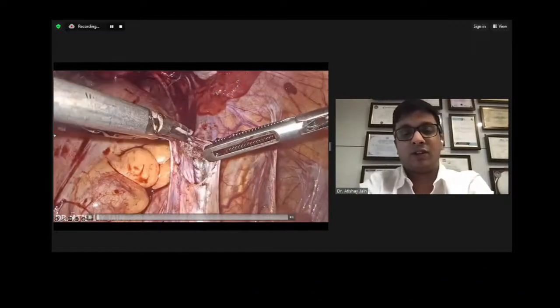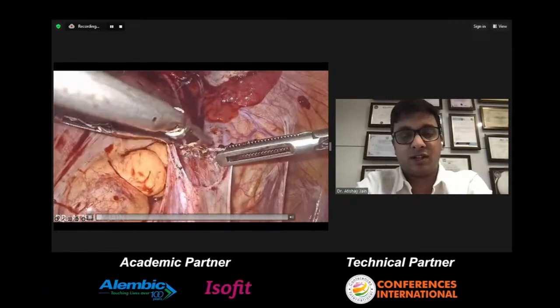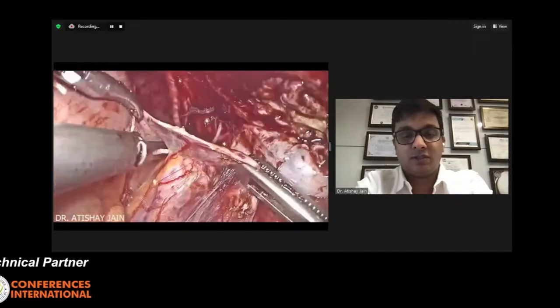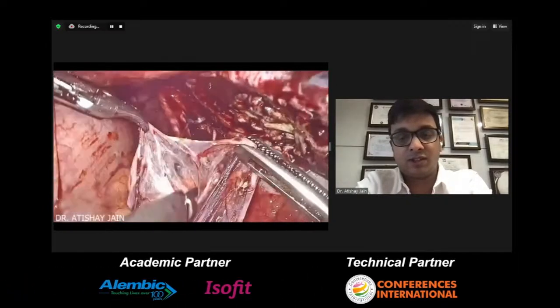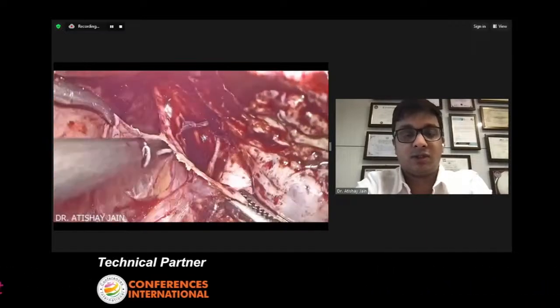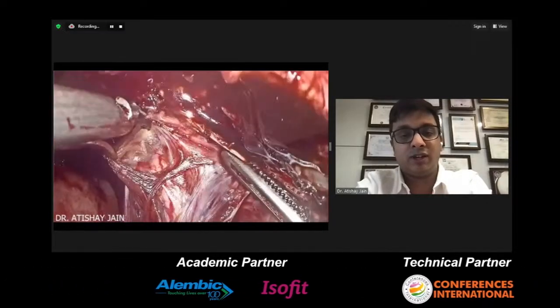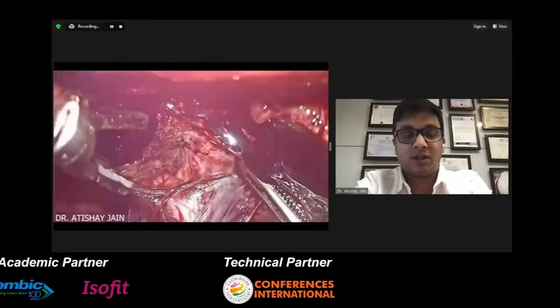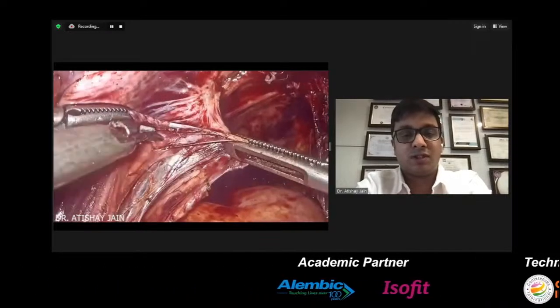So here is a case of deep infiltrating endometriosis. Here we start from the pelvic brim, the unaffected or the virgin area, and then we start with visualizing the ureter. So the ureter can be confirmed by its peristalsis and its vascularity, and keep going down, and always keep the ureter under vision and then cut. And sometimes you can just use the ureter to open the spaces.